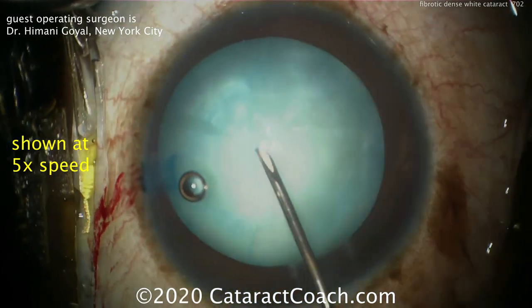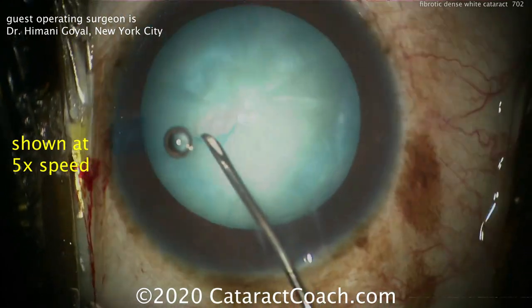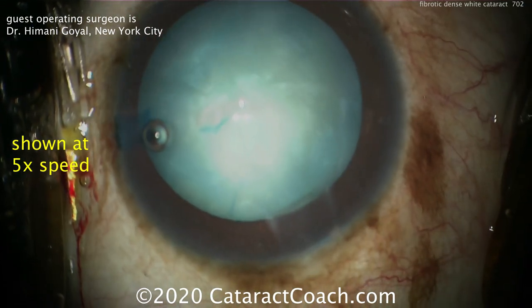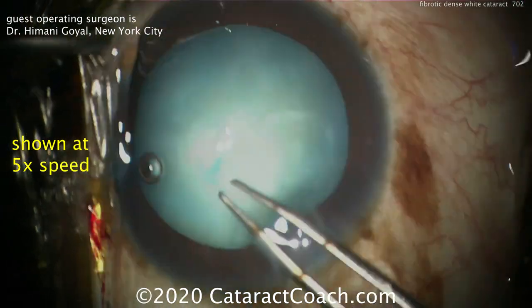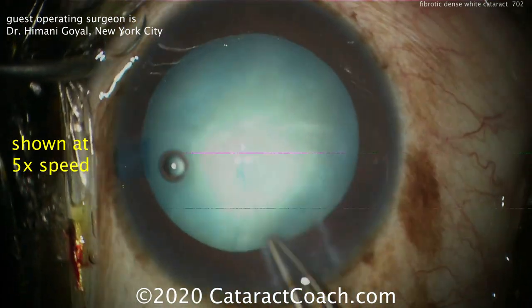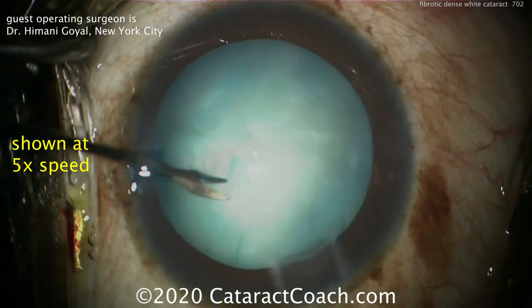This is a patient with a long-standing dense white cataract. After Trypan Blue dye staining, the cystotome is being used to start a capsulorrhexis. You can see centrally that big white area is a plaque. It was started with the cystotome and now grabbed with the utrata forceps, and as it's brought around, it just gets stuck at that one spot.